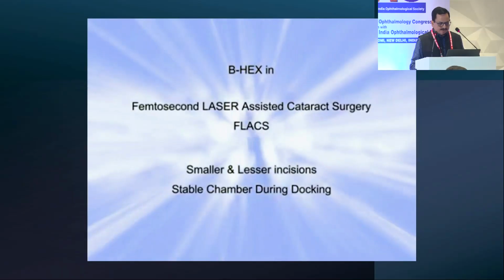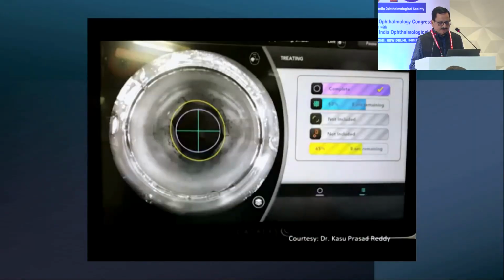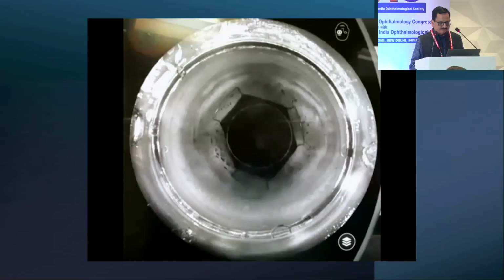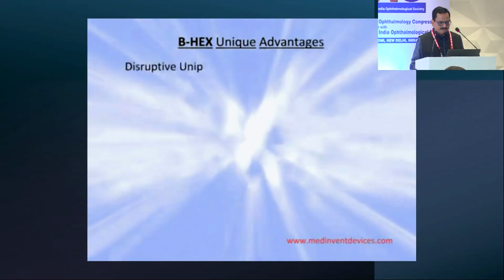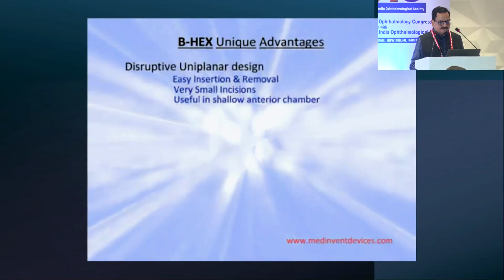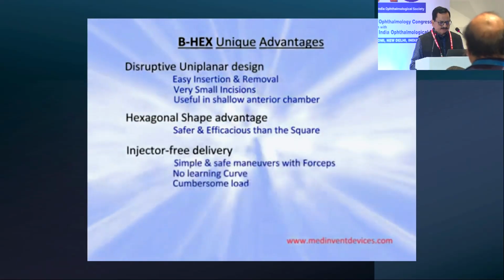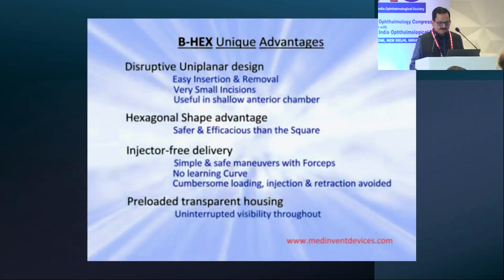This is an advantage in femtosecond laser assisted cataract surgery, where it helps maintain a well-formed anterior chamber during docking. The unique advantages are a disruptive uniplanar design, the hexagonal shape, an injector-free delivery system, and a preloaded device in a transparent housing.